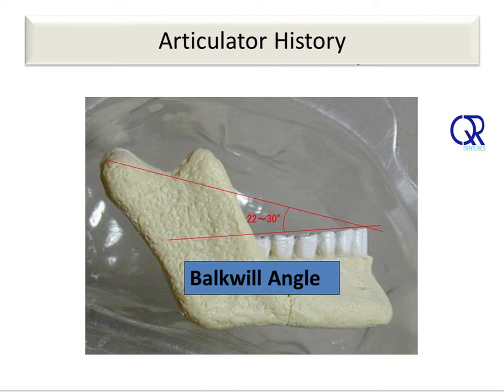The condyle articulates with the glenoid cavity so as to allow a single hinge-like motion and a forward and backward motion. Whilst there is only a slight lateral motion, both sides move on the radii of the same circle. He went further by saying, the combined motion of both circles will give the rotating side nearly a simple lateral action, while the orbiting side will move forward and downward.